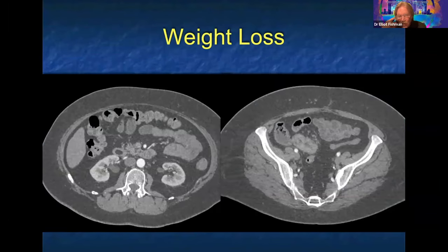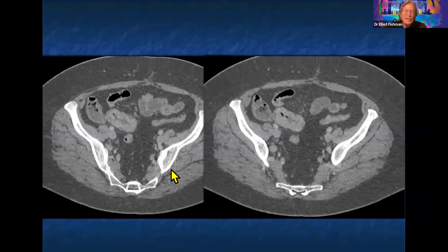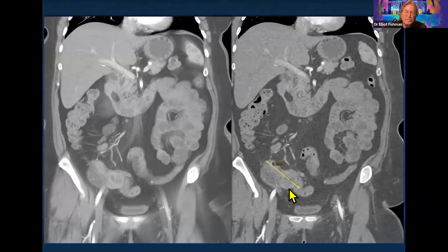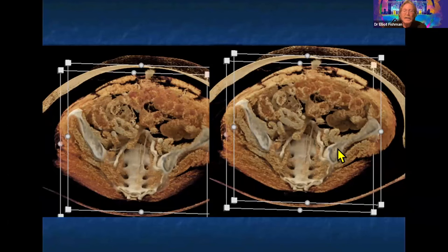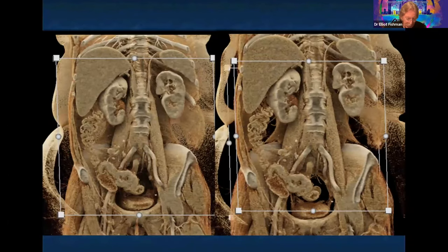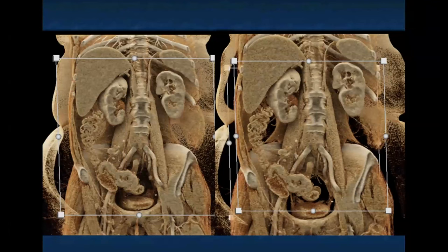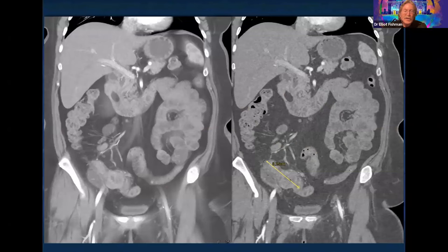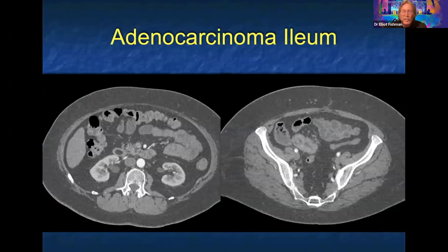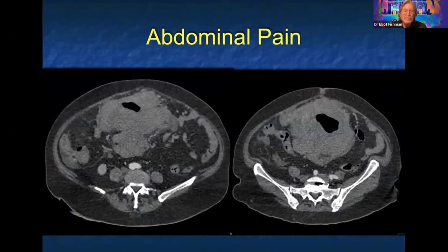Patient with weight loss and GI bleeding — the next few are going to be bowel cases. Here it is on cinematic rendering. What are we thinking? Answers included liposarcoma, Crohn's, ulcerative colitis, ileal mass, carcinoma, lymphoma — that's a reasonable differential. It's focal. This ended up being adenocarcinoma, but it could be lymphoma. If it were Crohn's, I would worry about Crohn's developing a carcinoma given the wall thickness.